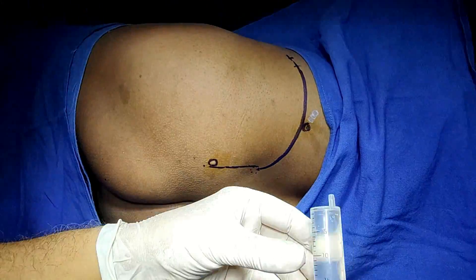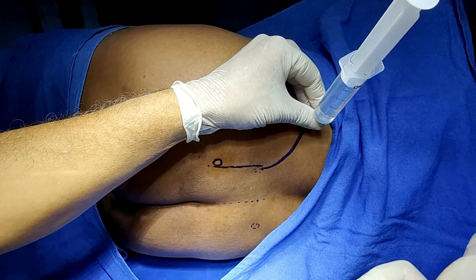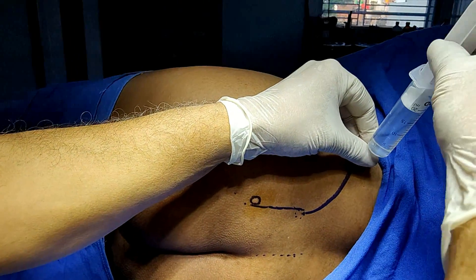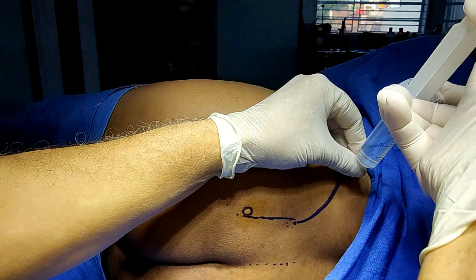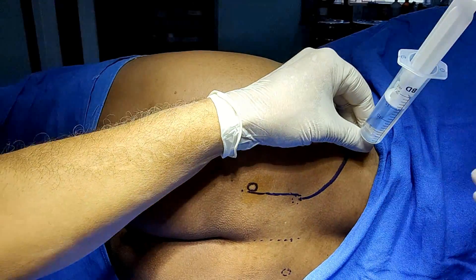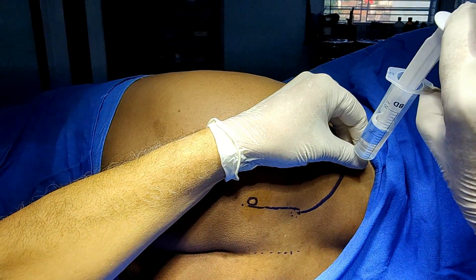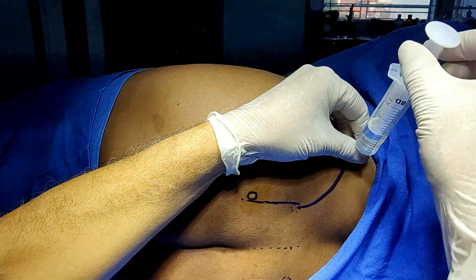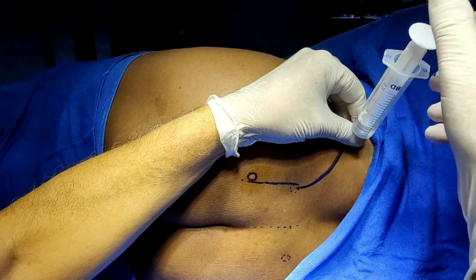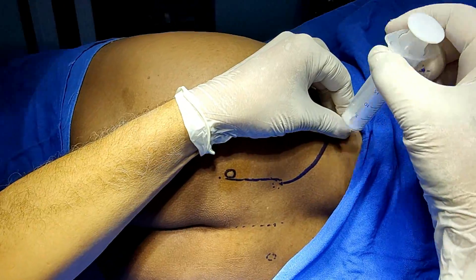There is no resistance. Take 20 ml of local anesthetic solution, connect it here, and stabilize. Aspirate — nothing is there. Rotate the needle, aspirate again, then inject. Keep watch on the pulse. This is the psoas compartment block with my own technique. Aspirate again and then inject.